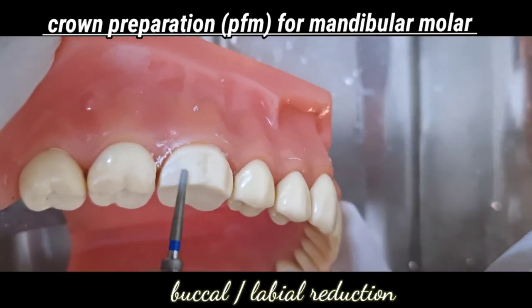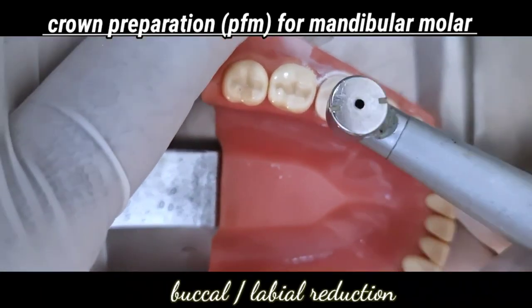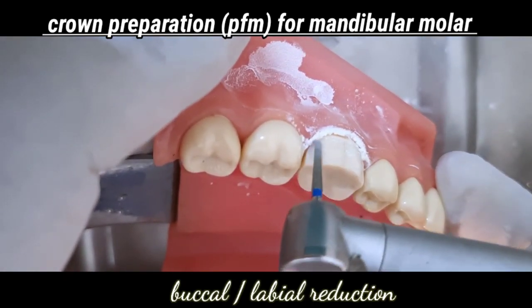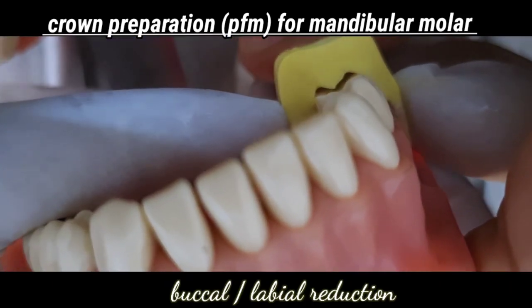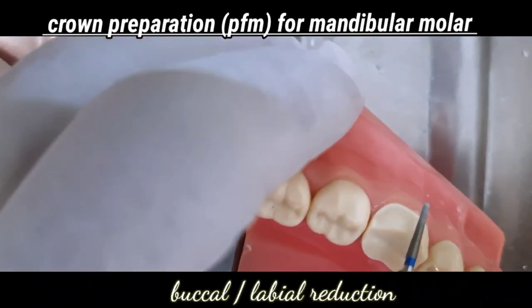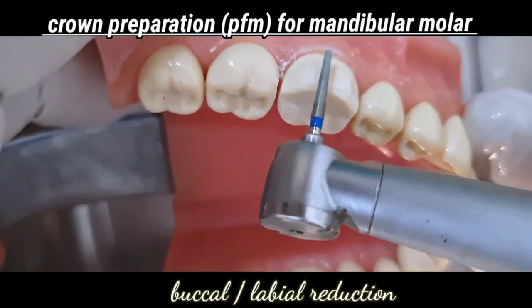It is very important to avoid continuous or back and forth motion of the burr, as it can result in unwanted deepening of the depth grooves, which will result in non-uniform reduction. So the handpiece is moved either push or pull, which is a unidirectional sweeping motion while reducing the crown. Buccal preparation is extended as far as possible into the proximal embrasures without opening the contact or nicking the adjacent tooth. So we keep checking it with a putty index. The biplanar reduction.